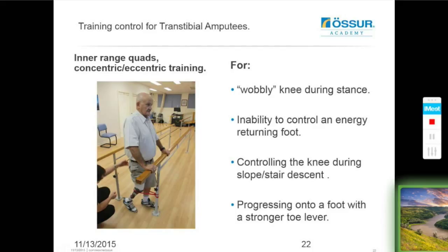While we're focusing on flexion problems with transtibial amputees, we're going to have a look at the fine knee control that needs to be trained in terms of concentric and eccentric flexion extension training for the transtibial amputee. And I'd use this type of exercise where we're weight bearing through the toe, we have a TheraBand position behind the knee joint, and he's just going to flex and extend that knee strongly off the prosthetic toe.